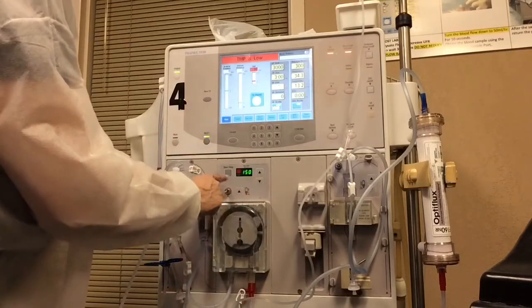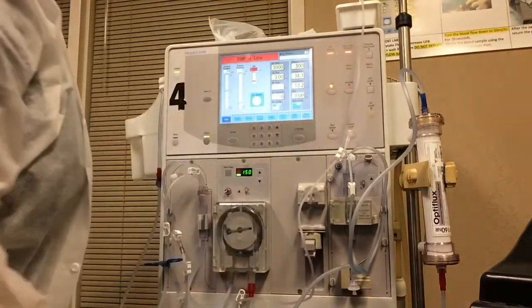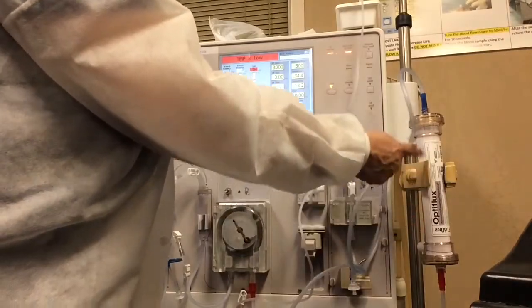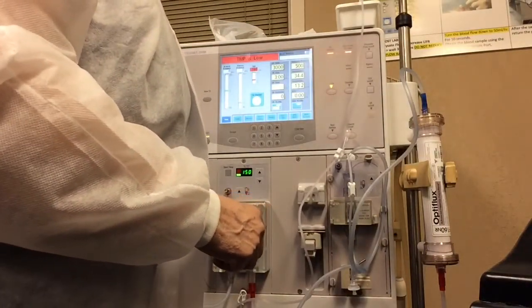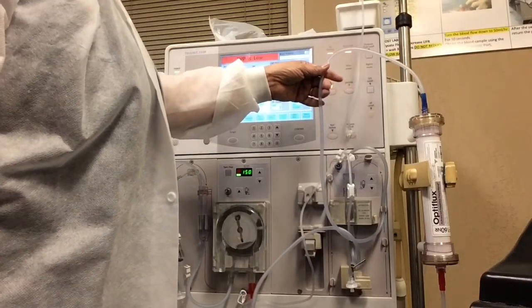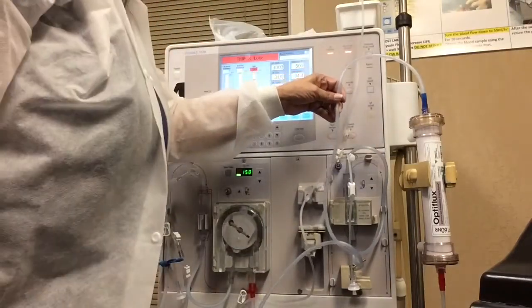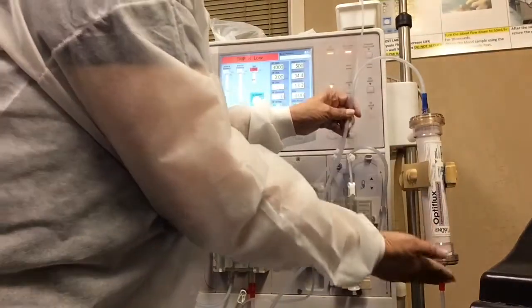Now you're going to turn on your blood pump — if it's flashing, that means it's off. This is on, and we're going to push prime. You can see saline coming down the bottom of the blood pump segment through the dialyzer. Why leave it at 150? Take it to 500 — get that saline going through there and prime this in 2 minutes, 1 minute, 30 seconds.